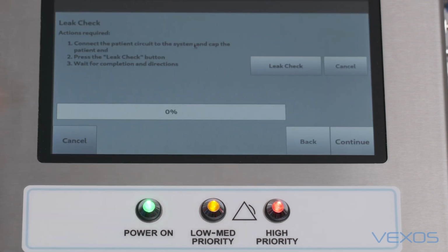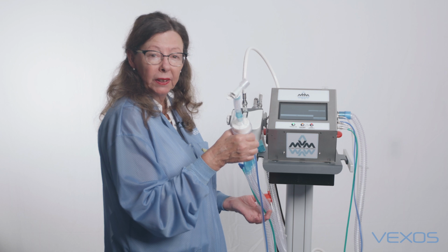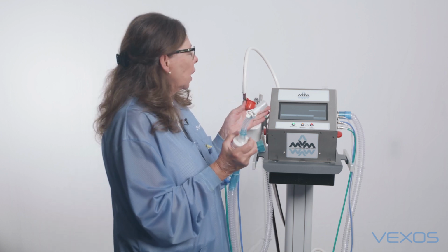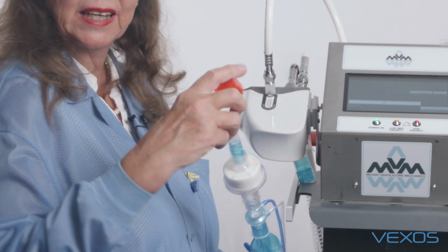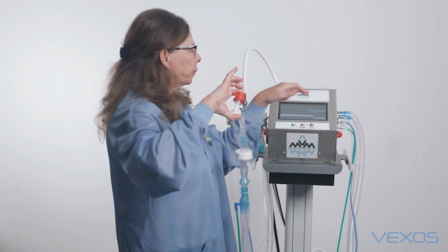The leak test is one of the first tests in the self-test. The leak test is very important to ensure that the circuit has no leaks. Follow the directions on the screen, connect the circuit, and plug the end of the circuit with a cap. The cap keeps the circuit clean. Hold the cap fairly firmly and begin the check.